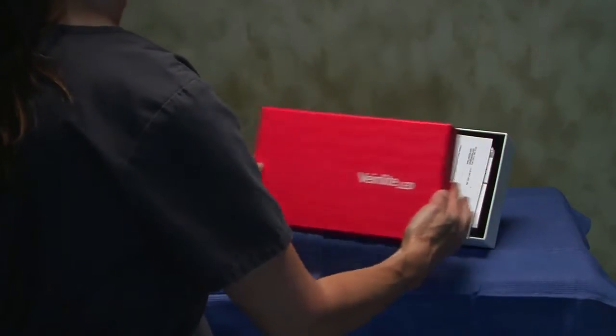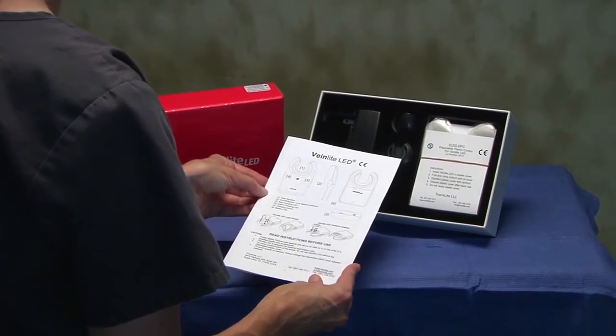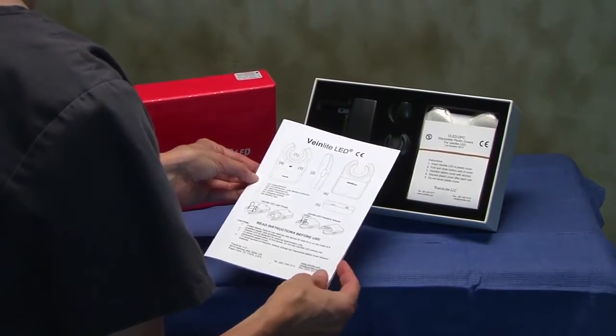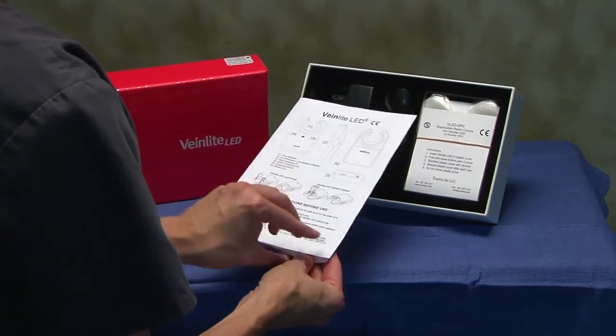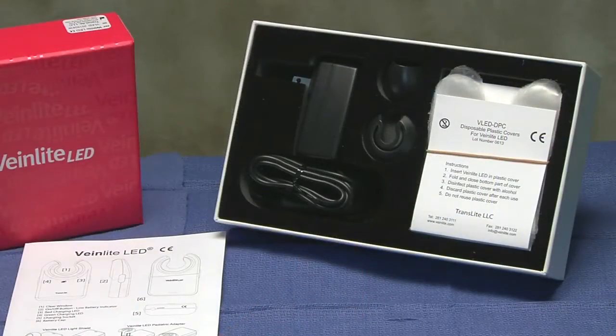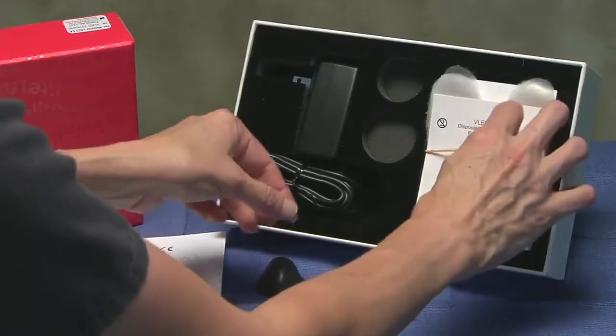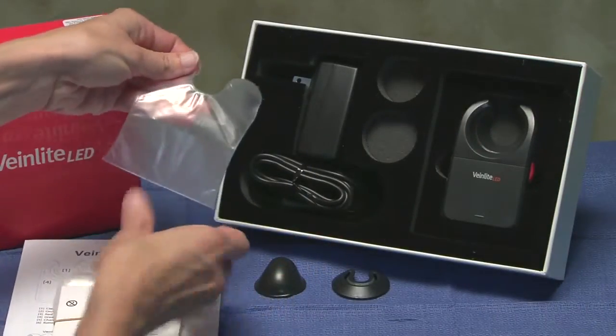When you open your VeinLight kit, you will first see a detailed user's manual. Please review the manual carefully for proper operation and maintenance information before using your VeinLight. In addition to your VeinLight device, your kit may contain several accessories, such as a charger, pediatric and light shield attachments, and a starter pack of disposable plastic covers.